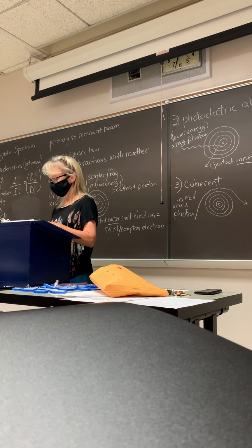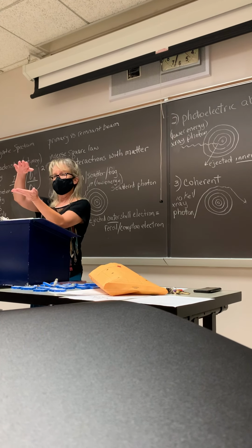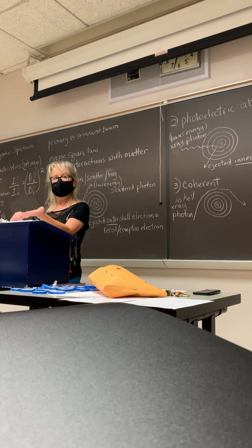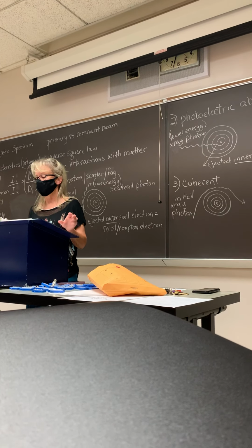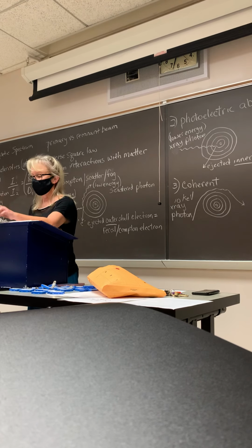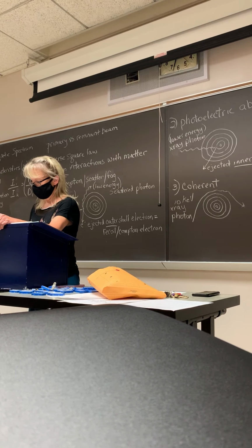It decreases their dose because you're kind of decreasing the SID by doing that. Okay, magnification mode, I'm going to go over some other time in the spring.